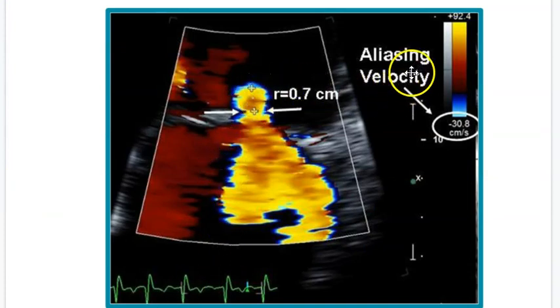We talked about using the baseline adjustment. Remember the color is flowing this way in mitral regurgitation. This is our left ventricle up here, regurgitating back into the left atrium. And we're going to try to determine, using the continuity principle, the quantity of blood that's going back into there. And utilizing the continuity principle, we can adjust our baseline.